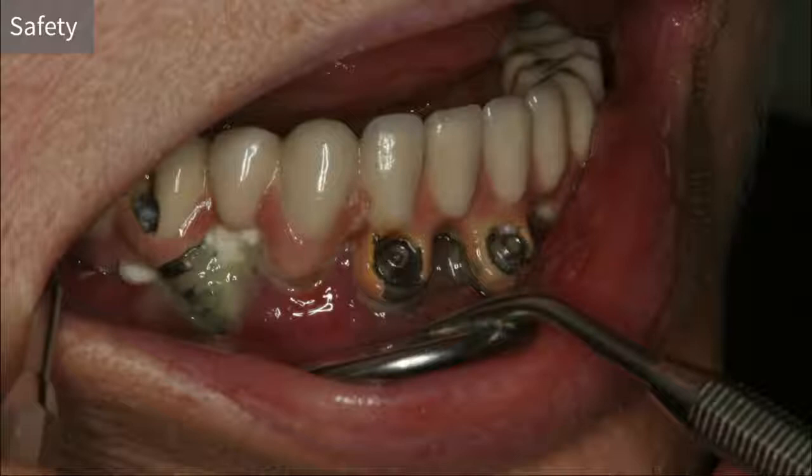And this picture is a final picture. Of course, here you see that there are many, many mistakes done, not only by the surgeon, but by the technician, by the prosthetician. So these are extremely hard cases to handle and to retreat. Of course, we have to extract everything. A long healing time needs to be allowed. And then there is an enormous lack of bone and lack of soft tissue after the healing period. So many times serious bone graftings are required prior to implantation. These cases are extremely hard to handle.